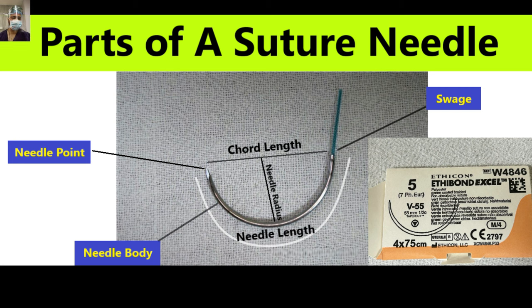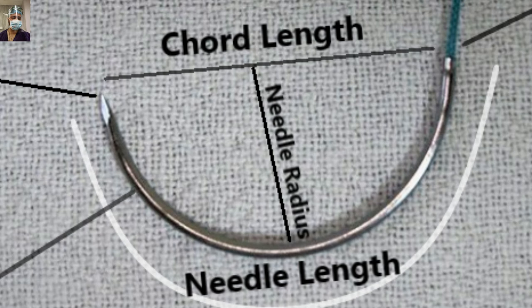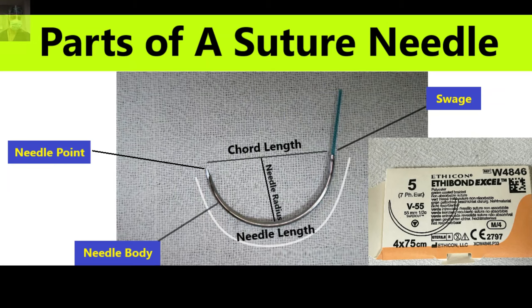This is a needle of number 5 ethibond, which is used basically in thoracotomy surgery. This is one of the thickest materials available — number 5, made of polyester. The different parts of the needle: the chord length is from the swage end — that is basically the suture end — to the tip. That is chord length.